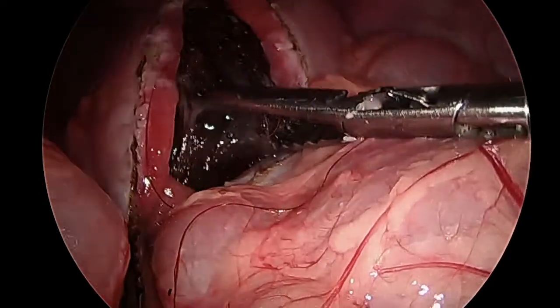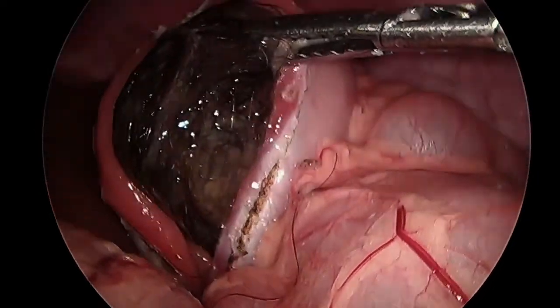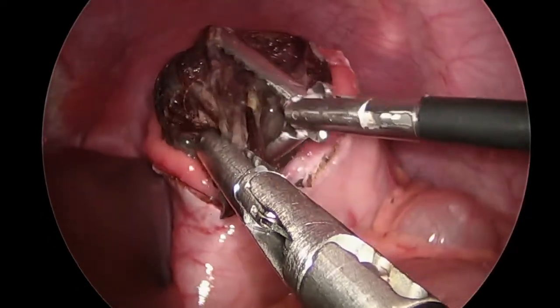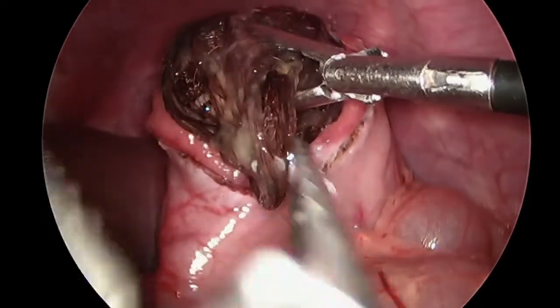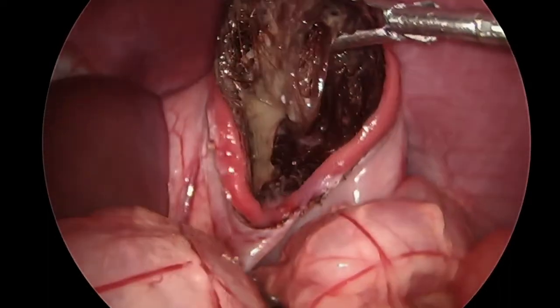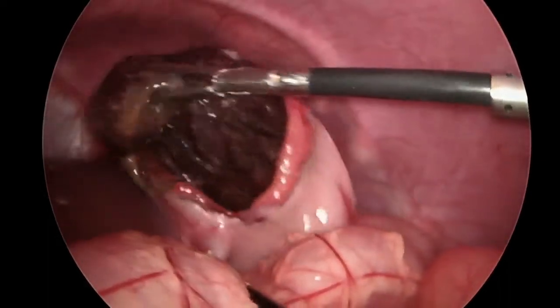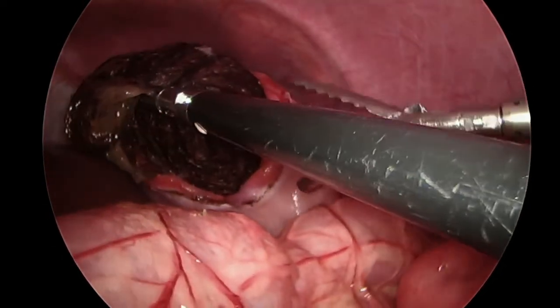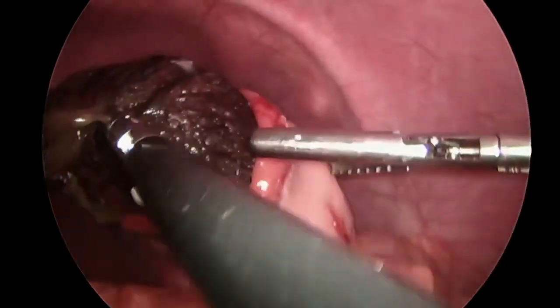Using two graspers, the trichobezoar was gently manipulated out of the stomach and into the peritoneal cavity, ensuring that the tail of hair extending into the duodenum was also carefully removed. A key aspect of removing the trichobezoar from the stomach is to peel the gastric wall away from the trichobezoar, rather than to pull the trichobezoar from the stomach — much like peeling a banana.